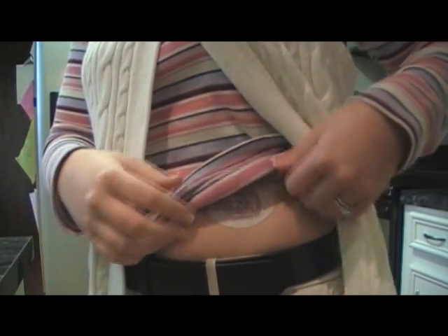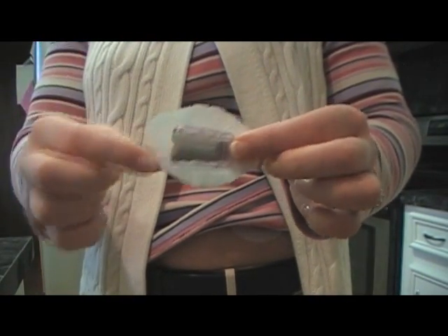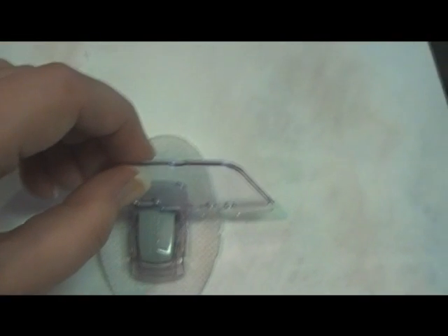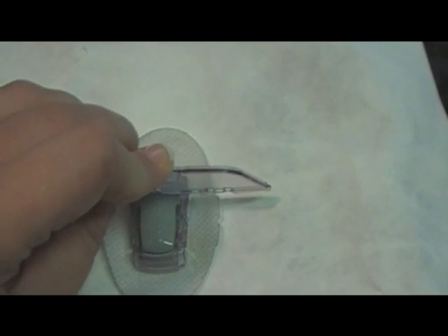Now I'm going to show you how to take the transmitter out. This part's very easy. You see these two little things right here? There is a little space on either side right here. All you do is just put it in there and press down. And if you heard it click, that means it's out — and it is. Then you lay it to the side and get ready to put it in the new sensor holder.